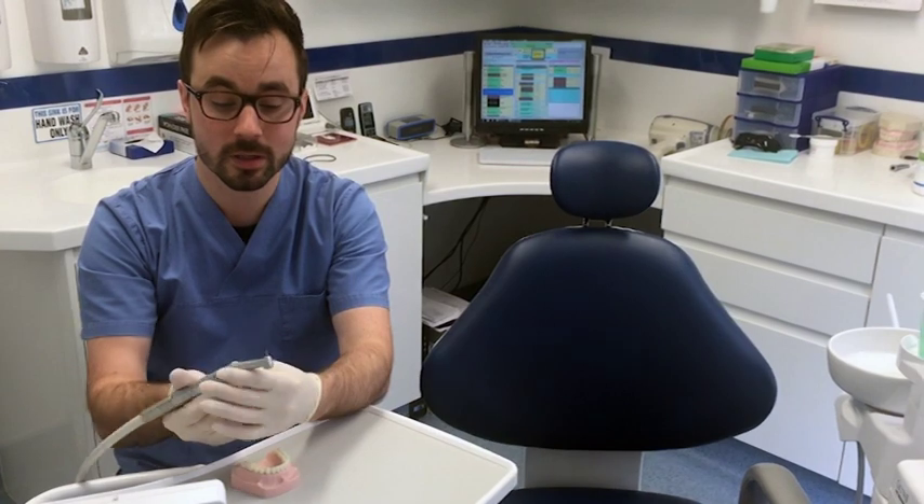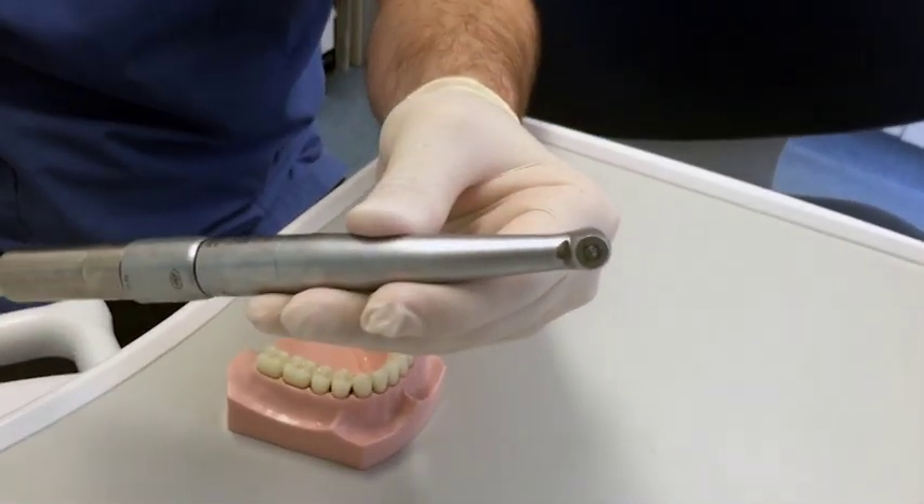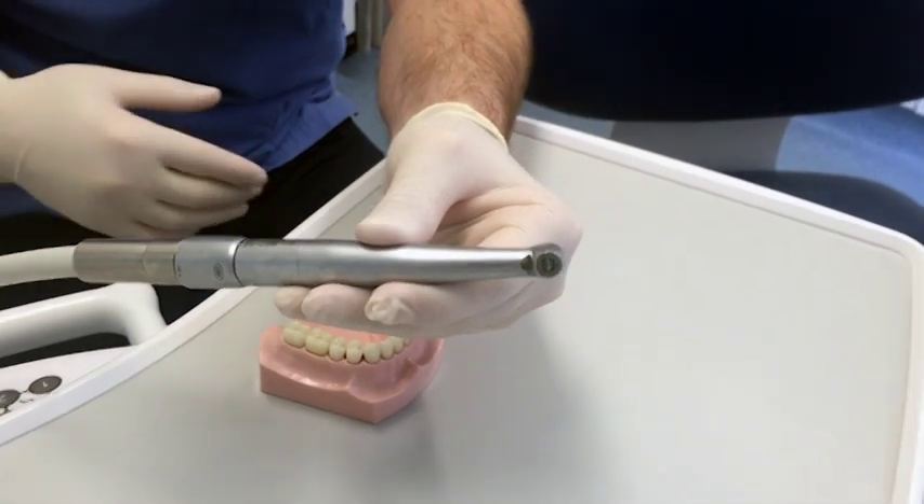This particular drill also has an LED light inside, which activates when I put my foot on the pedal on the floor.